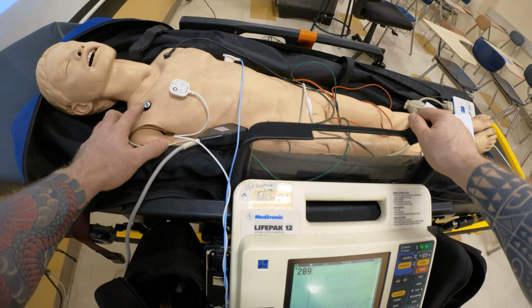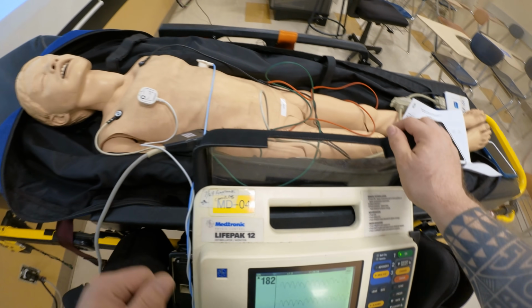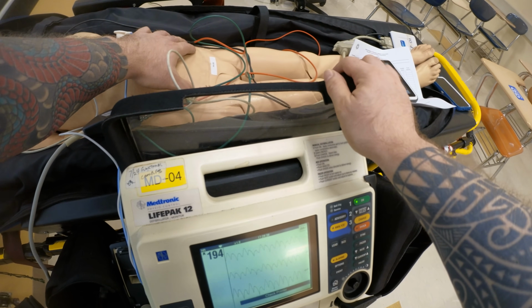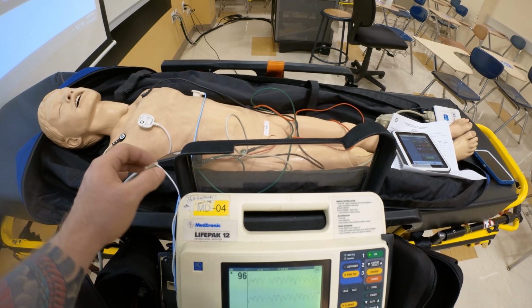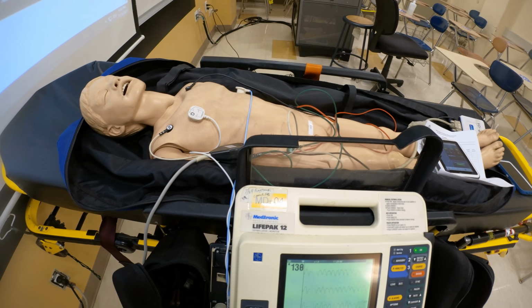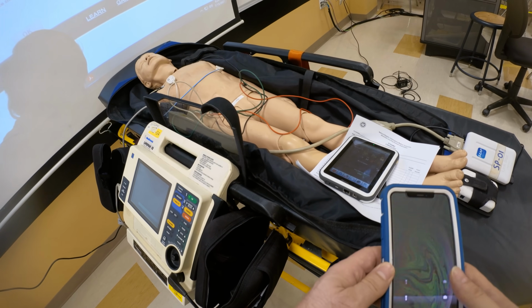So instead of having the appropriate locations, right, right arm, left arm, and so forth, and the quick way I teach it, it's pepper, ketchup, relish, I see these in the wrong locations, right? So if you see them in the wrong locations, you will have erroneous rhythms displayed. So this is something you want to, again, make sure the students are actually able to place the limb leads appropriately for this patient, right?